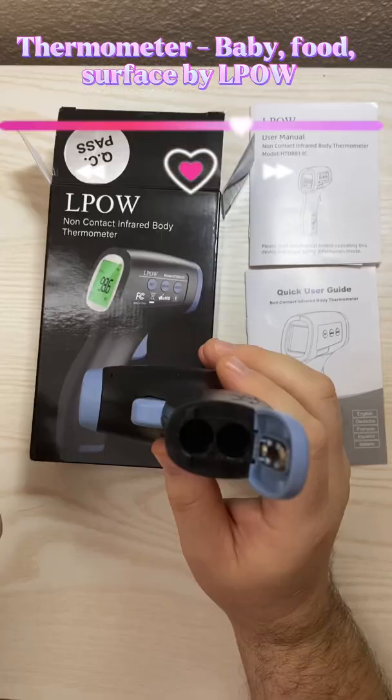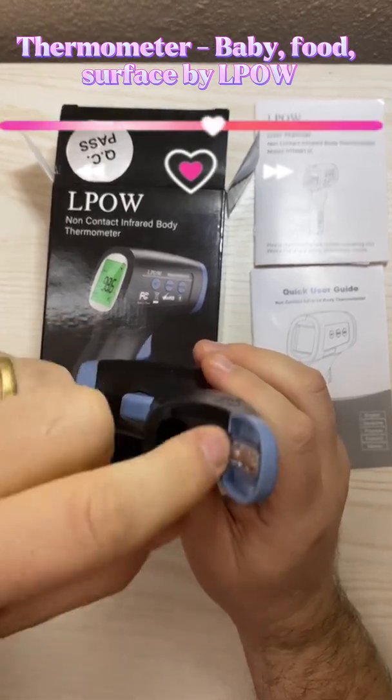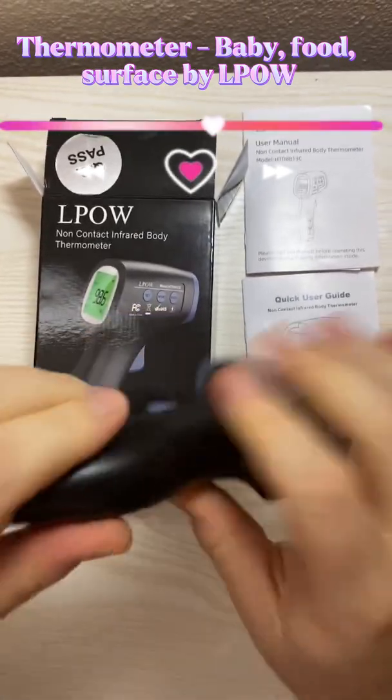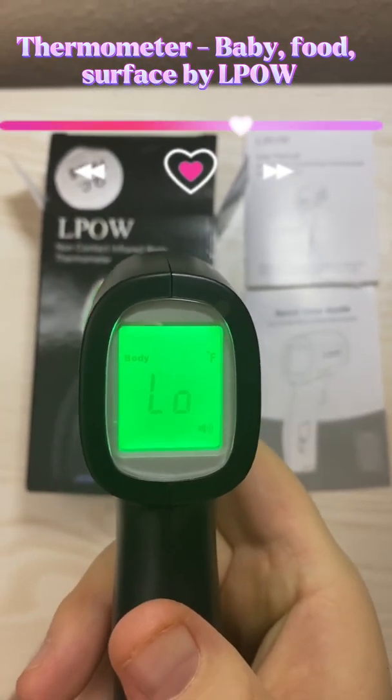Let's put the batteries in. Just press the button to turn it on. It has a nice green backlight there.